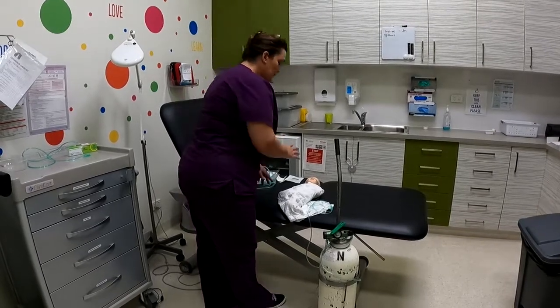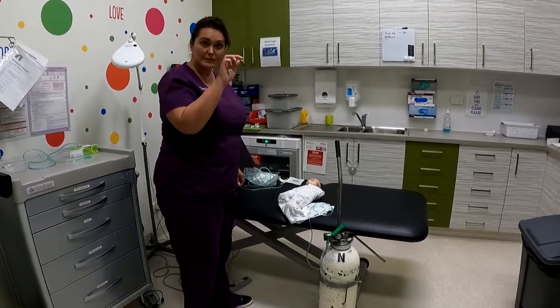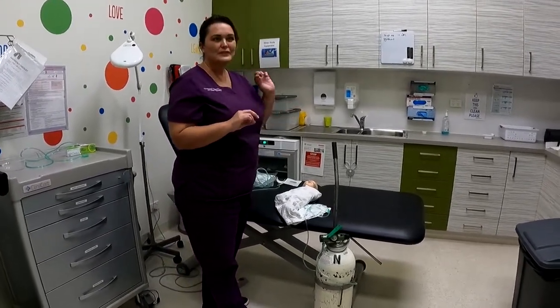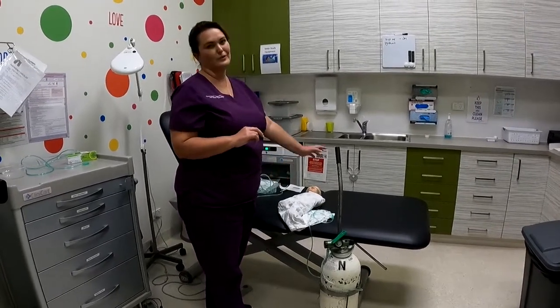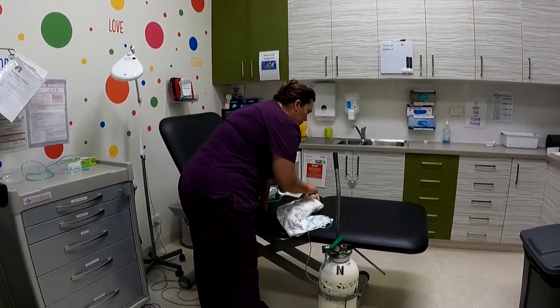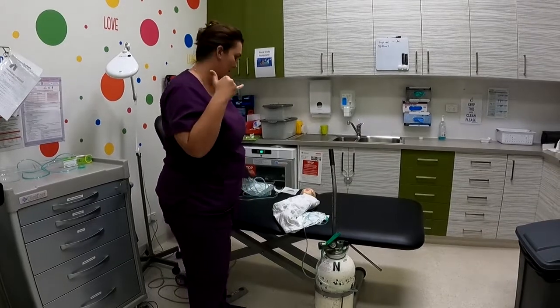Then you want to just have a look at their oxygen. So gently pull the prongs out of their nose and make sure that you can see the end of the oxygen prongs and make sure they're not blocked with any secretions. If they're starting to block, you'll often hear a bit of a high-pitched whistle. And if they are blocked, you will need to probably change your prongs, and we'll go through that. Just make sure that they're not pressed up too hard on the bridge of your baby's nose, because it might just cause them to get a little red, uncomfortable area there.